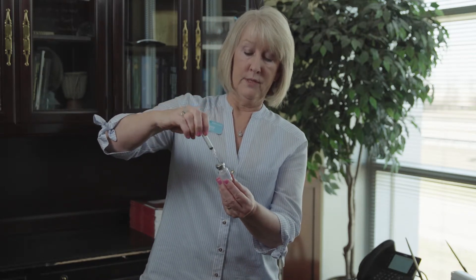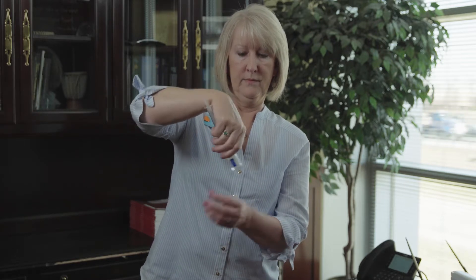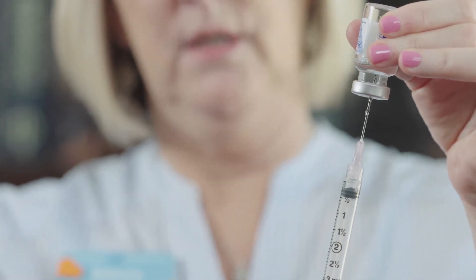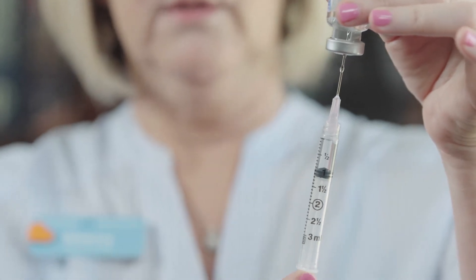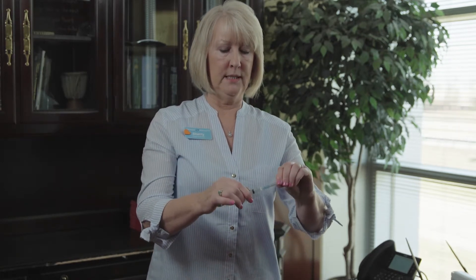If you see particles in the liquid, you want to gently swirl and then turn the vial over. You are going to pull out one mil of mixed medication, which is equivalent to 5,000 units of Pregnel. When the top of the black stopper is at the one, turn the vial over, pull your needle out, carefully recap your needle by putting it in the cap, unscrew your mixing needle and discard it, and place your injecting needle on.